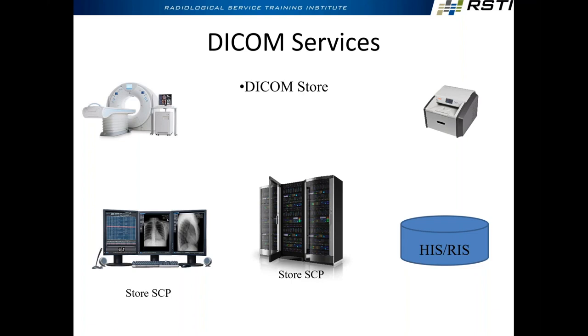Yeah, agreed. How do you even get here though? Could they come from here directly? No, sure. If that's the case, he needs to be a storage provider. If the image is only being pulled from here, then he is the query retrieve user, and this guy is the provider. So it all depends on the workflow, is what I'm getting at.